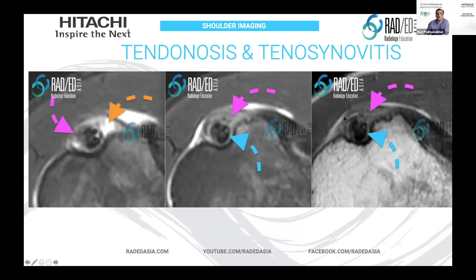On the PD fat sat and PD images, what we see in other areas is intermediate signal filling the tendon sheath. This is inflammatory change — this is a synovitis. So we have normal fluid versus tenosynovitis with synovitis. If you gave contrast — there's no need to give contrast — but if you did, you would expect this inflammatory region to enhance, whereas pure fluid would not enhance. The margins might enhance, but the inflammatory tissue itself would enhance.